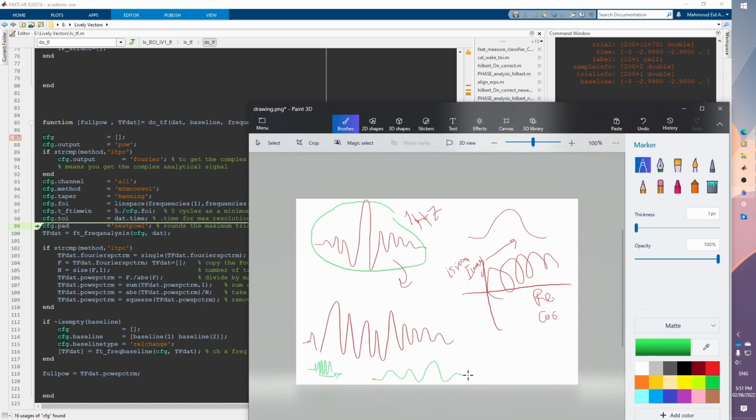and we end up with a value such that we will be building our new signal after applying this Morlet wavelet kernel, such that we will know the time resolution of this new signal, okay, and we know that the frequency was 1 Hertz.